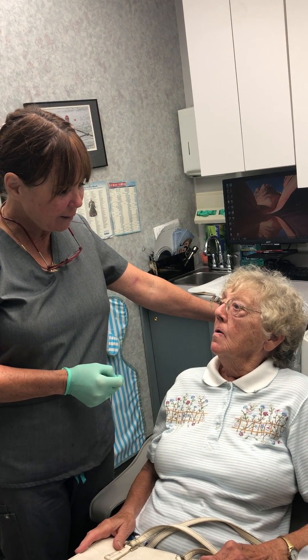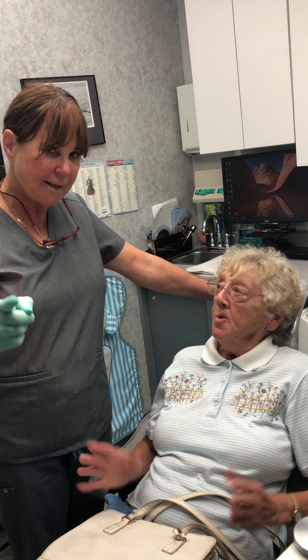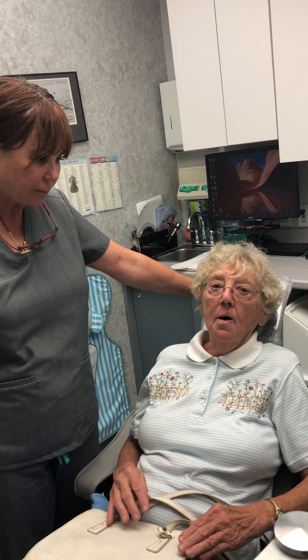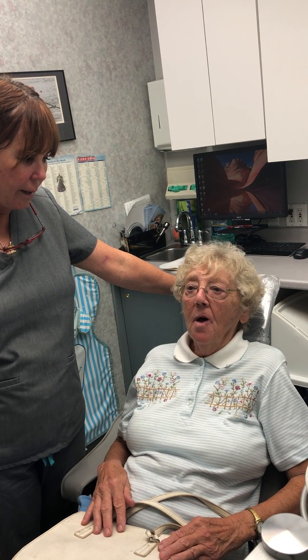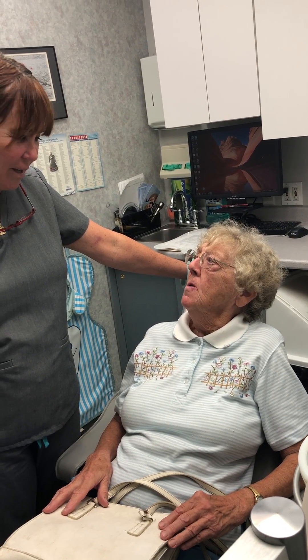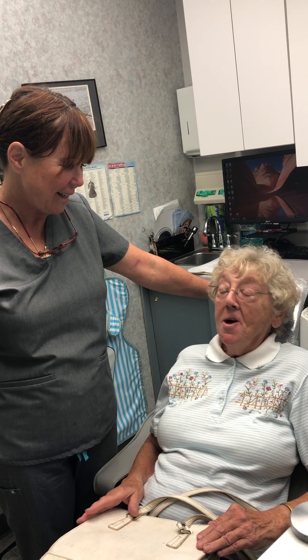Now you're able to eat everything — yeah, no problem. And tell people again how light it is. Oh, it's very light. I've never had one this light in my life. They were all just heavy, but this is wonderful. And for 14 years we haven't really done anything to it, and she's happy as a clam, right? I am, definitely.